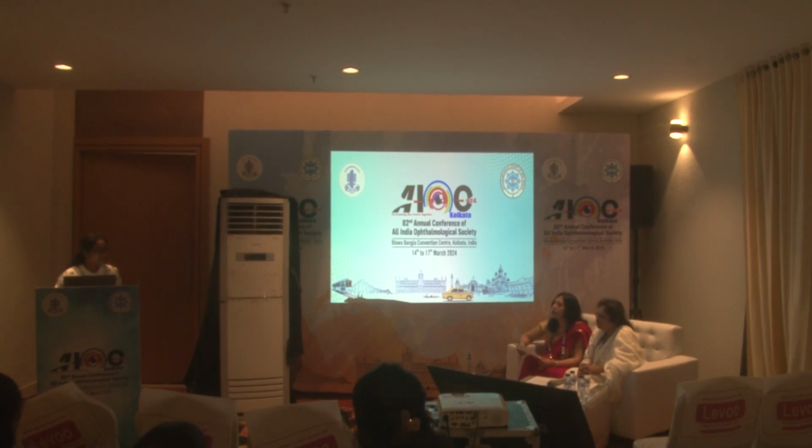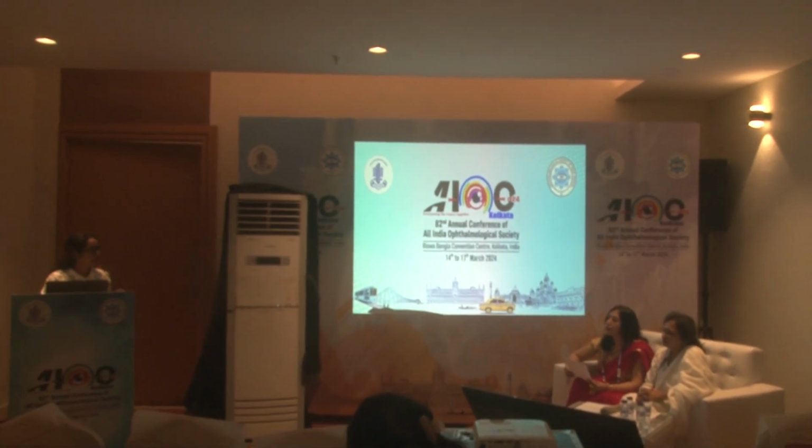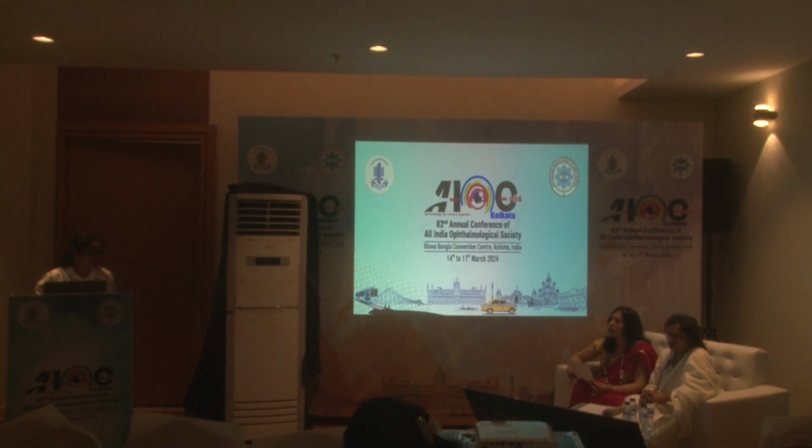Because whenever we are giving a large capsulotomy, we are giving more shots of the laser, so indirectly it is actually affecting the blood ocular barrier and also the vitreous interface. We are disturbing it, so it will lead to the inflammatory mediators acting and causing the macular thickness increase.